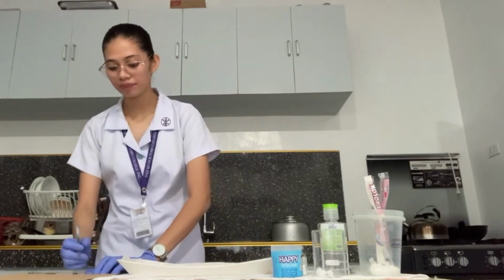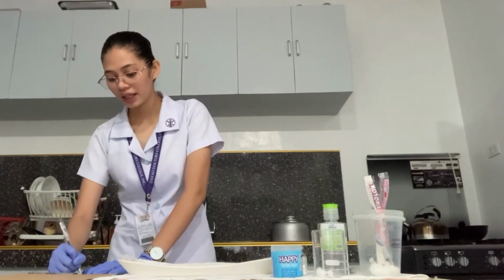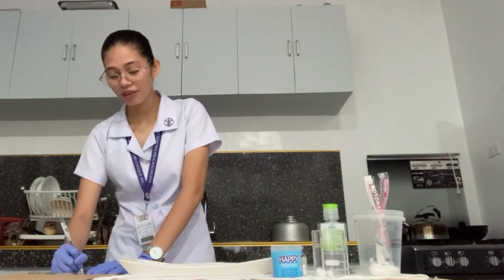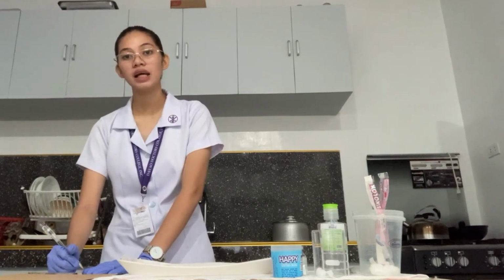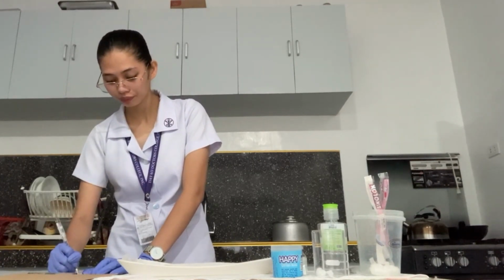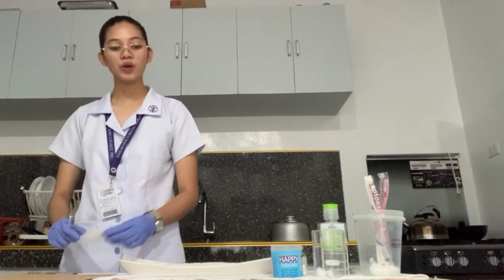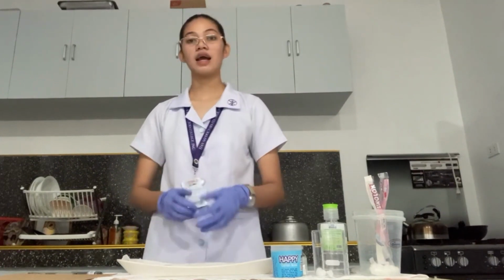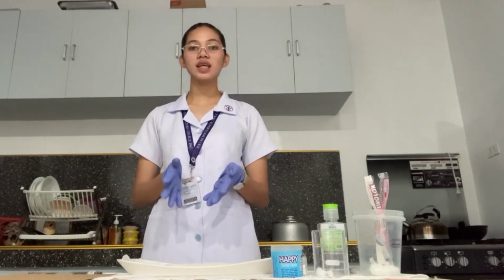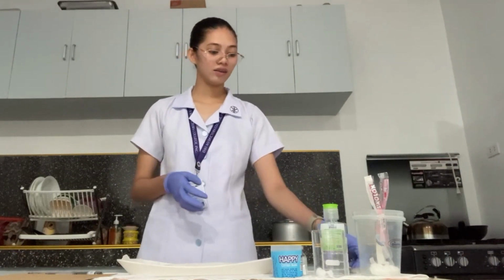Then we're going to write our medication ticket, making sure that we are writing the name of the medication, the name of the patient receiving the medication, the dosage, and the time it will be administered. And then after that, we're going to place it along with our syringe. Next is we're going to do the same thing on our other syringe for our subcutaneous medication.